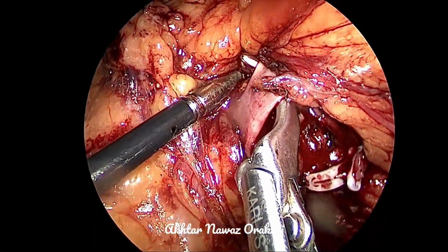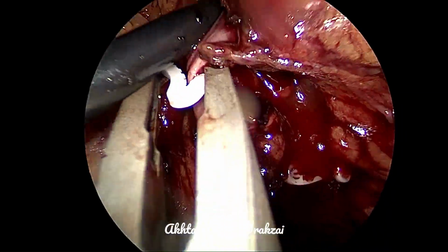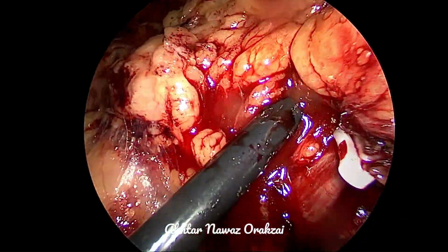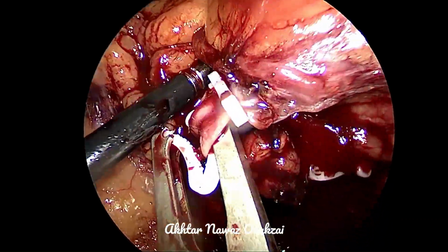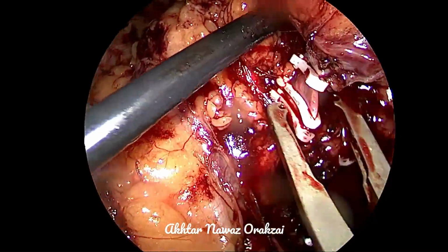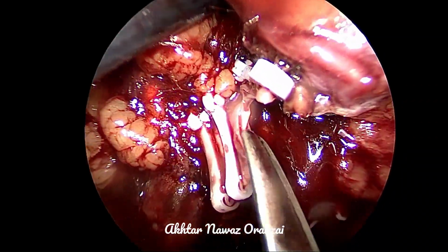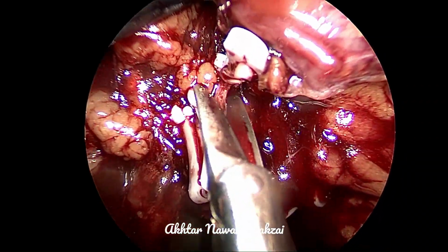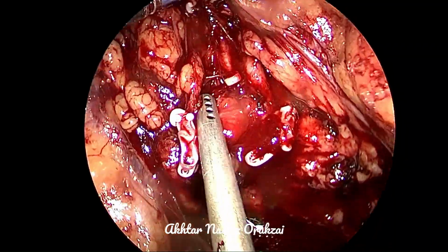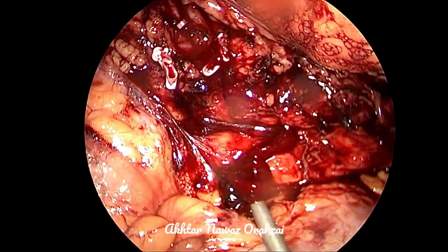However, in the process, I think we injured a small vein in the ureter, or maybe a small tributary of the renal vein, but it is not a major bleed. The patient is quite stable. We can see all the structures, so let's proceed with the clipping of the vein and then cutting it, rather than panicking. So now it is cut in half, and then slowly, gradually completing the cutting of the vein. You can see the surface of the aorta behind.